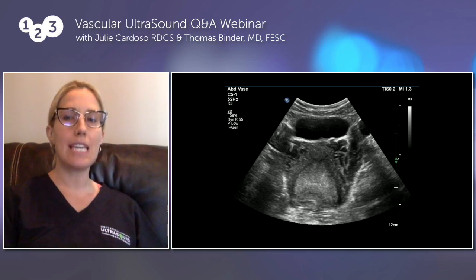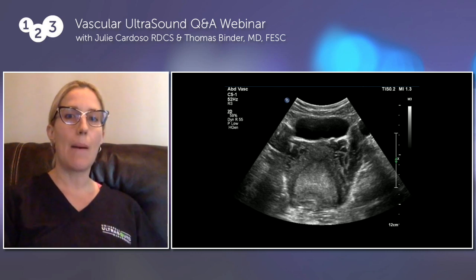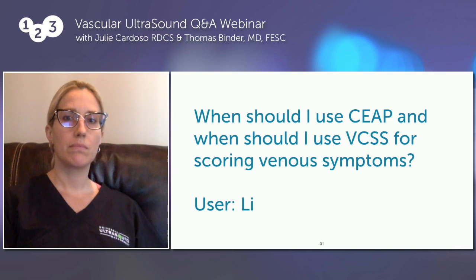So right now, as you can see on our image here, what we're going to be covering in our next course, this is a B-mode image of the uterus. And you can see on the right and the left hand of the screen, the periuterine veins. In the next image, you can see the color flow Doppler, and you can see flow within these veins and also reflux in these veins. So this is the color flow right here. Again, a wonderful way of helping your patients and diagnosing things very, very easily.